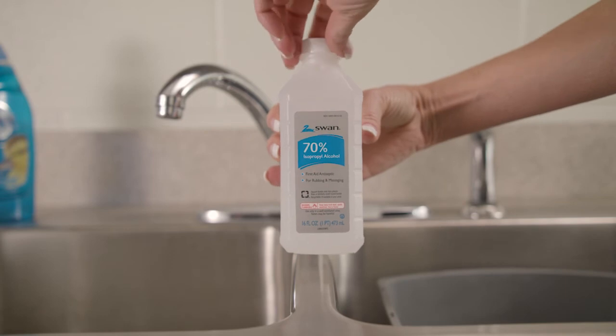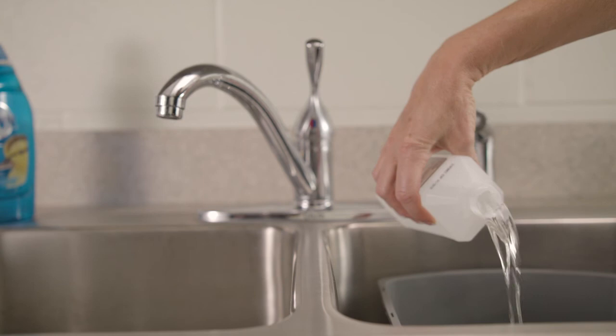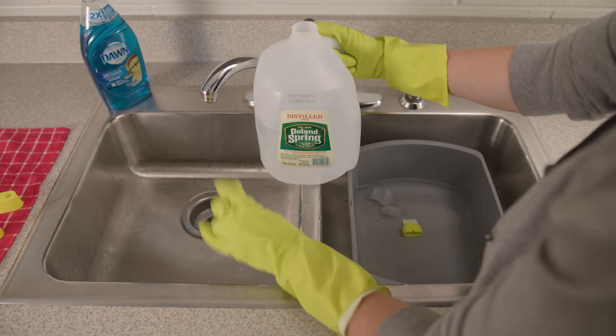You can also cold sterilize the Pocket PEP by soaking the parts in 70% isopropyl alcohol for 2 minutes. Be sure to wear plastic gloves when removing the parts. Rinse in distilled water and allow to air dry.